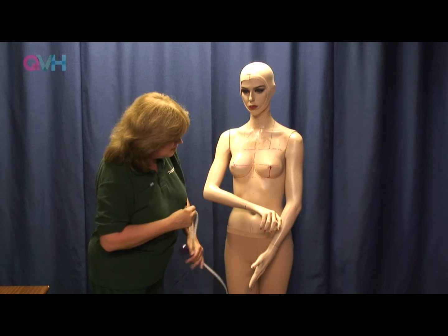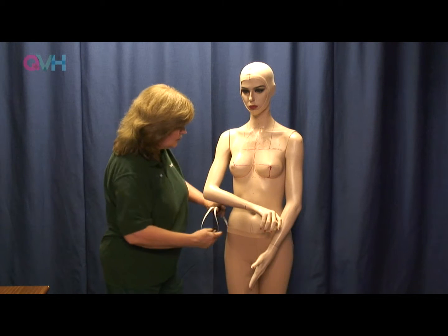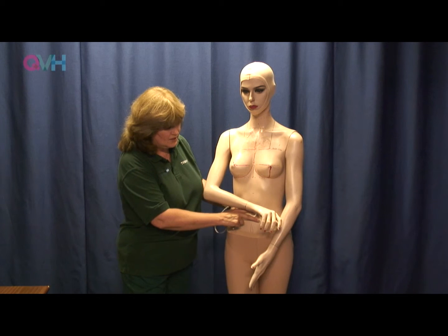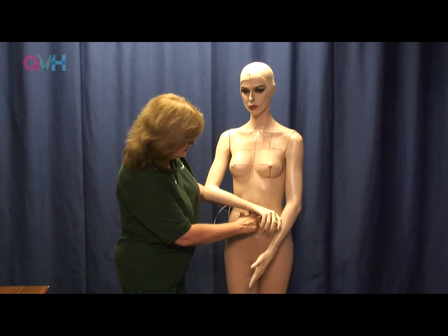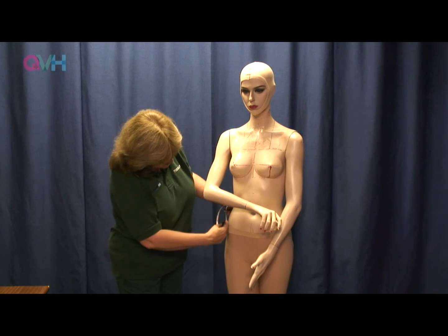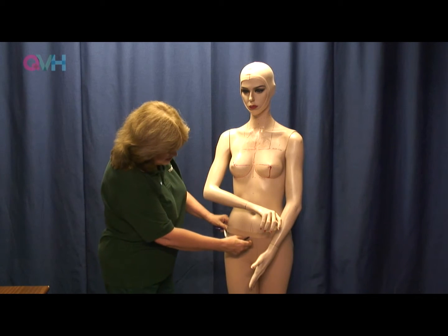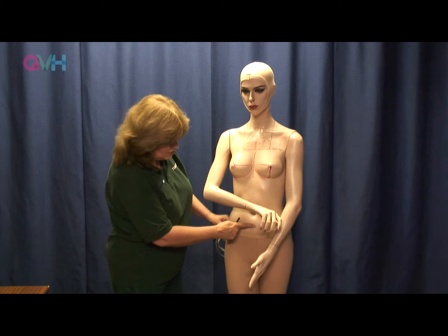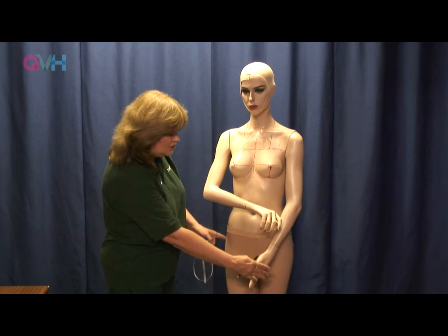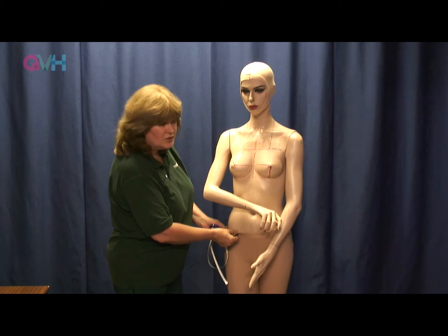Now that would be, if I am beyond the scar adequately, that would be a good place to stop, because it is the natural waistline, and it would grip, in this case with the woman's waist being significantly less than elsewhere, it would grip. Whereas if we needed to go further, we would have to travel further down and once again decide where it ended, make the marks and measure on those marks. But once you're going further out, you're going to flare for the hips, and you may well have the garment lifting, although of course that's when we put a silicone elastic on to grip.